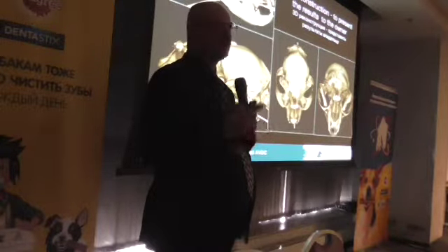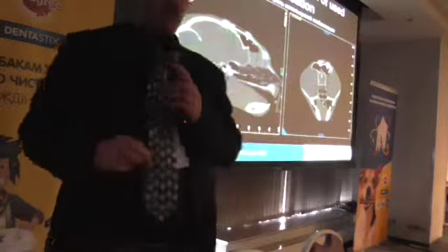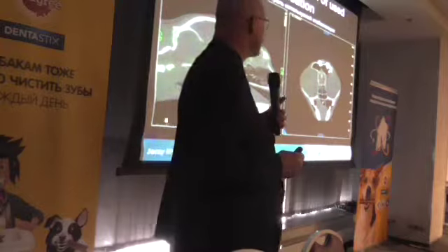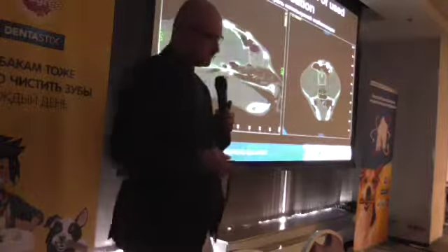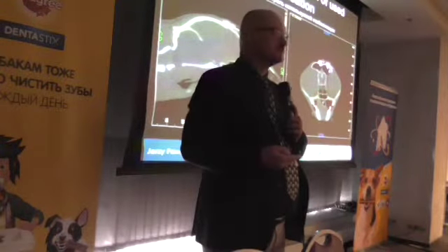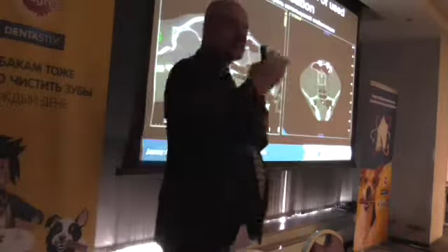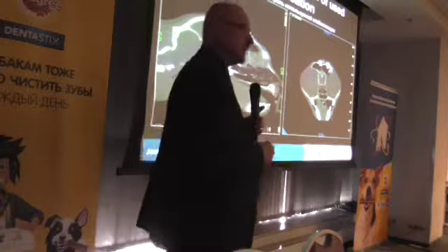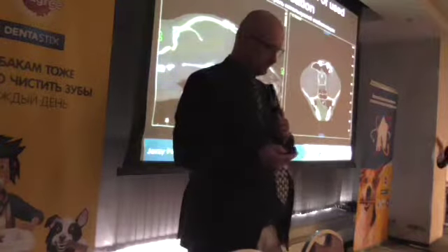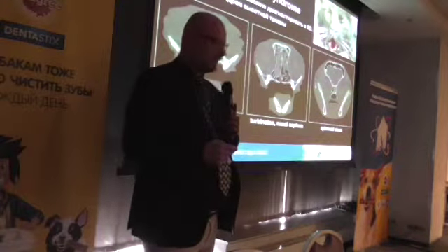This is important because we want to know how deep we penetrated with the micro screws, and we have to be sure that we didn't damage the brain. It is very important to understand what thickness we can count on when placing micro screws, to insure against brain tissue trauma. So that's again a much easier way of communicating with the owner and explaining all the potential risks and possibilities of the operation, rather than drawing it on paper.